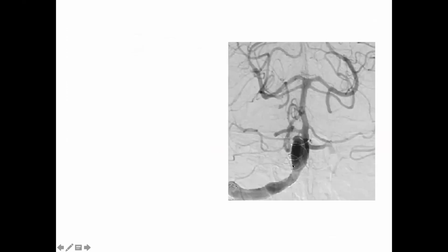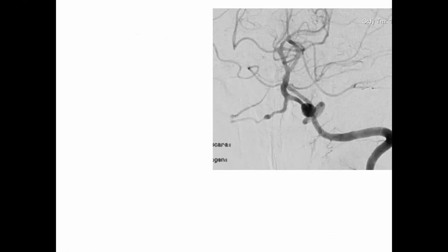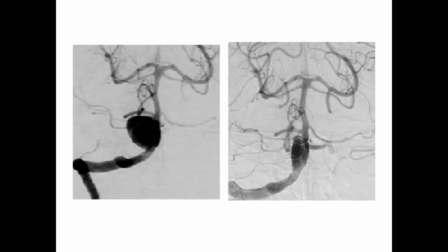And some weeks later, you see reduction of the size of the aneurysm. Control angio, AP view, before, after 1 week. And the patient is protected from this situation.